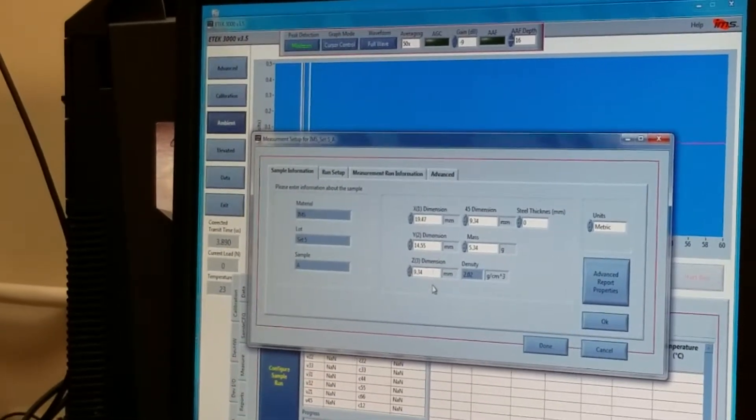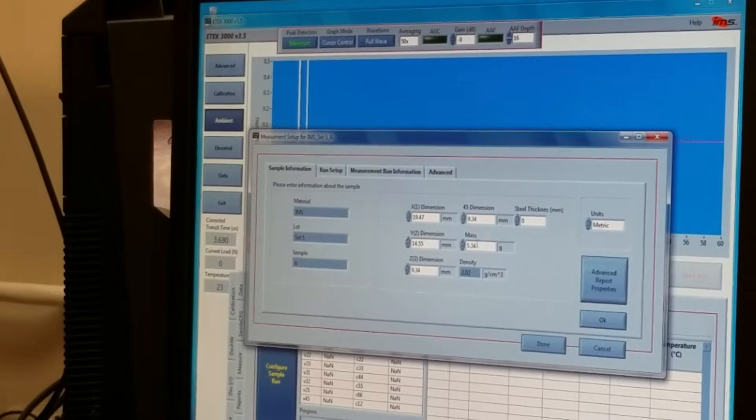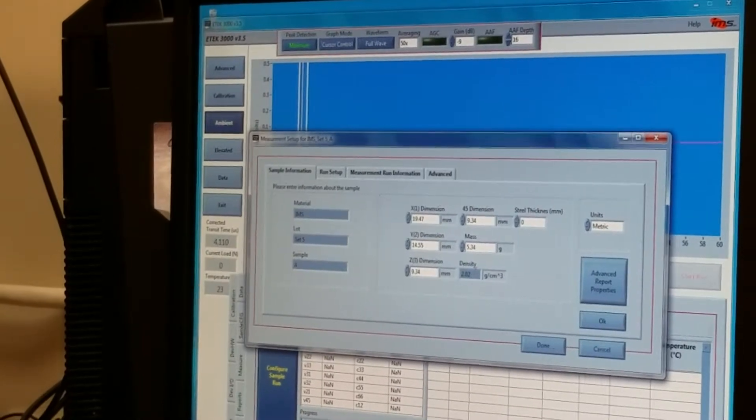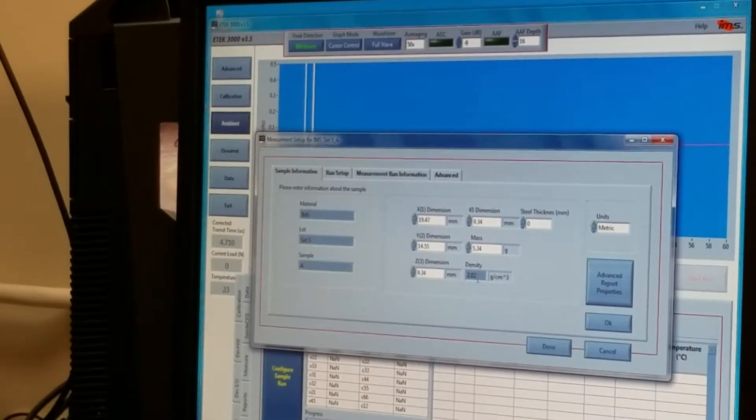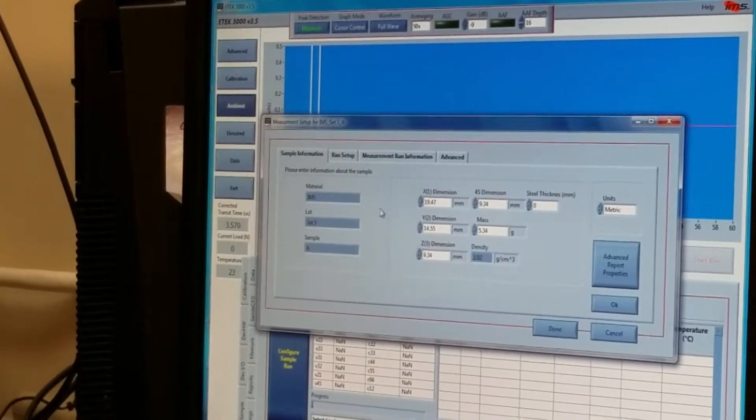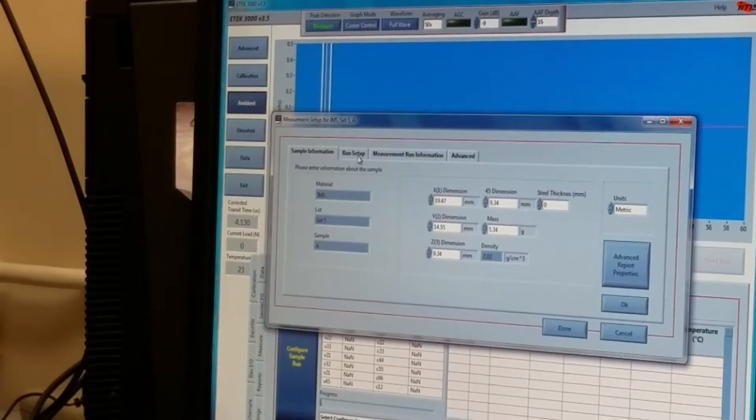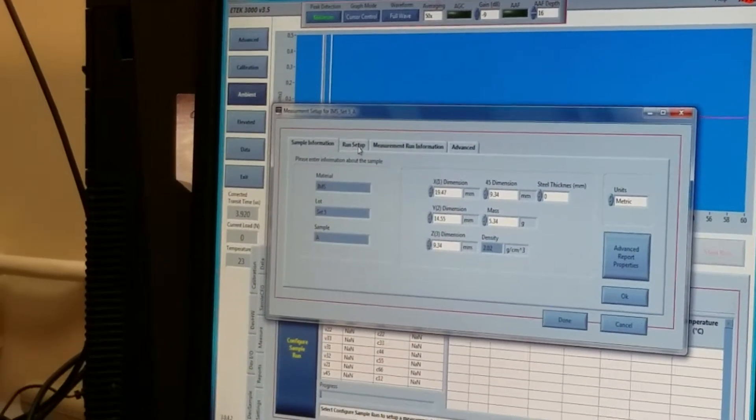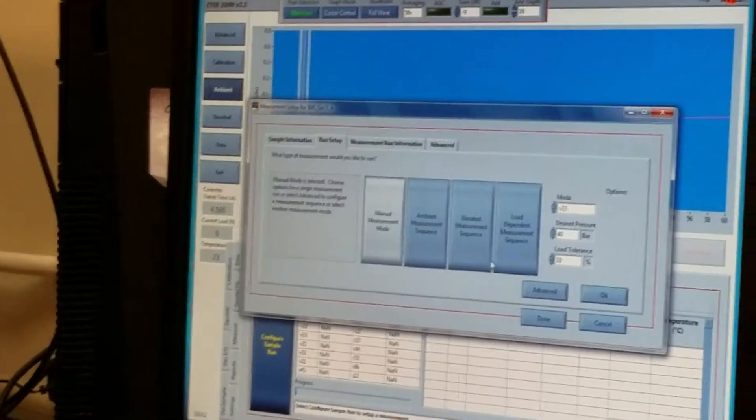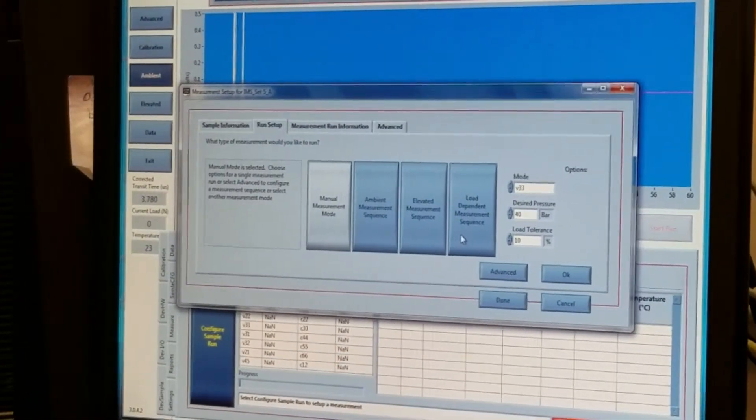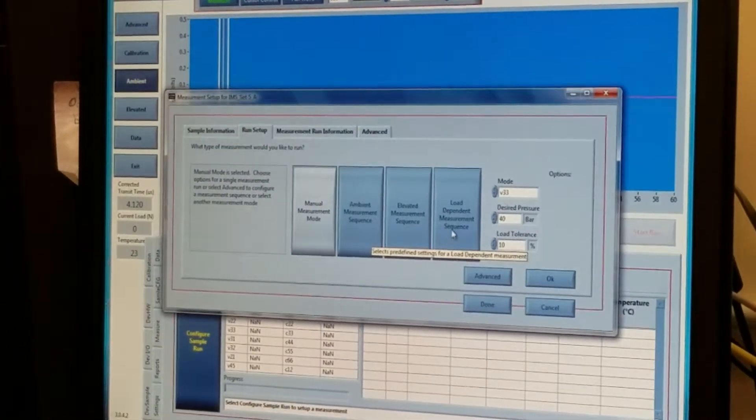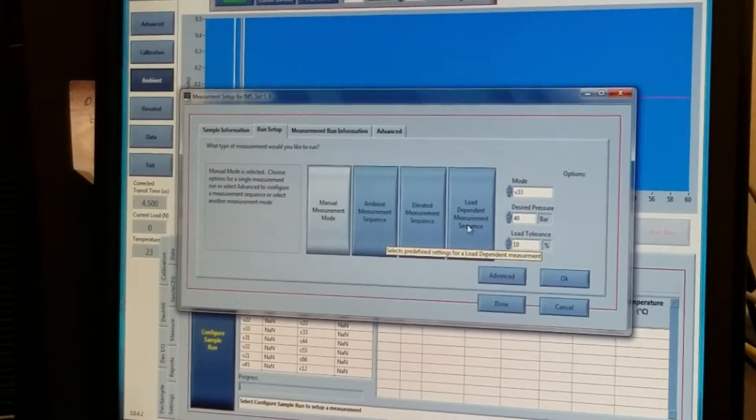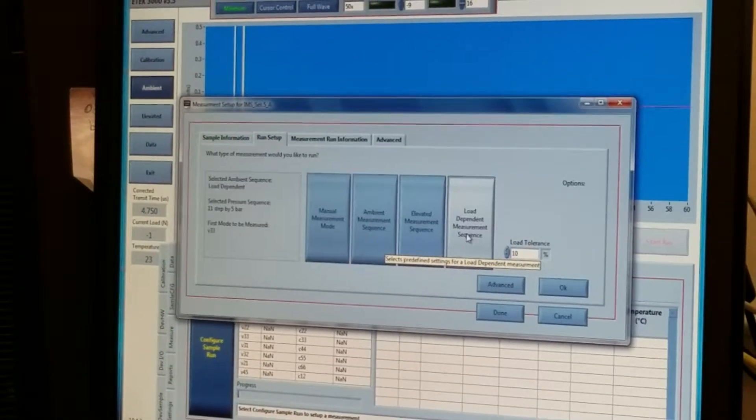I've entered the dimensions of the sample and the mass, and the density is automatically calculated. The next step is to click on the run setup tab, and this is where we select the measurement that we're going to make.